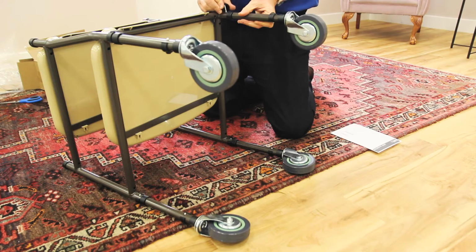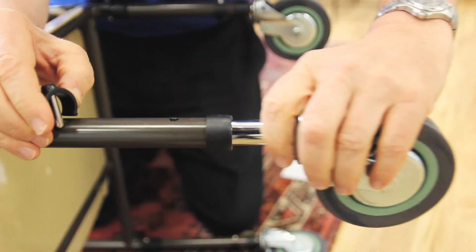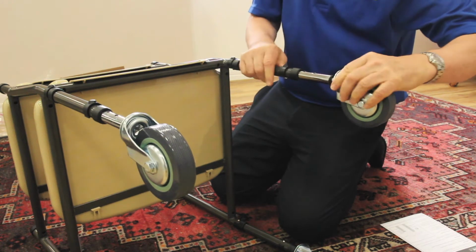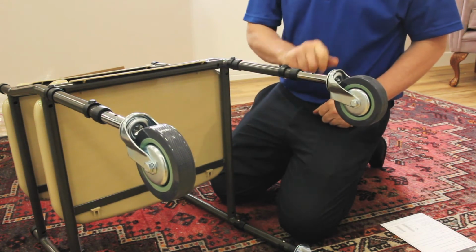If you wish to adjust the height of the trolley, remove the pins just above the wheels. Then push or pull the wheel until you find your desired height. Using the holes on the legs, you can ensure the legs are at a matching height. This will ensure greater comfort when moving with the trolley.